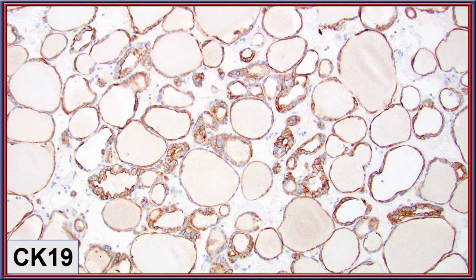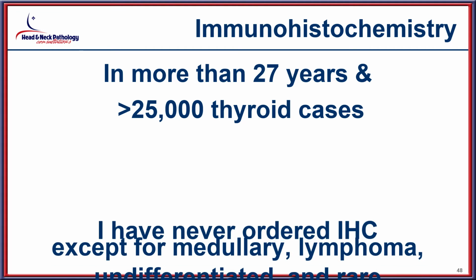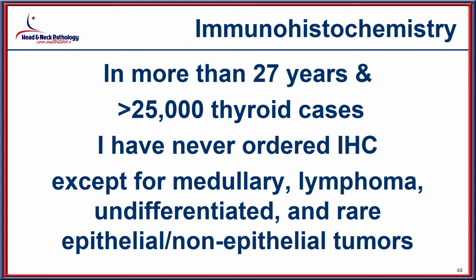And you may say, well, why are you showing it in this particular setting? Well, I'm showing it in order to make a point. In more than 27 years of doing thyroid pathology, and I've seen more than 25,000 thyroid cases during that time, I have never once ordered immunohistochemistry to confirm a diagnosis of papillary thyroid carcinoma.